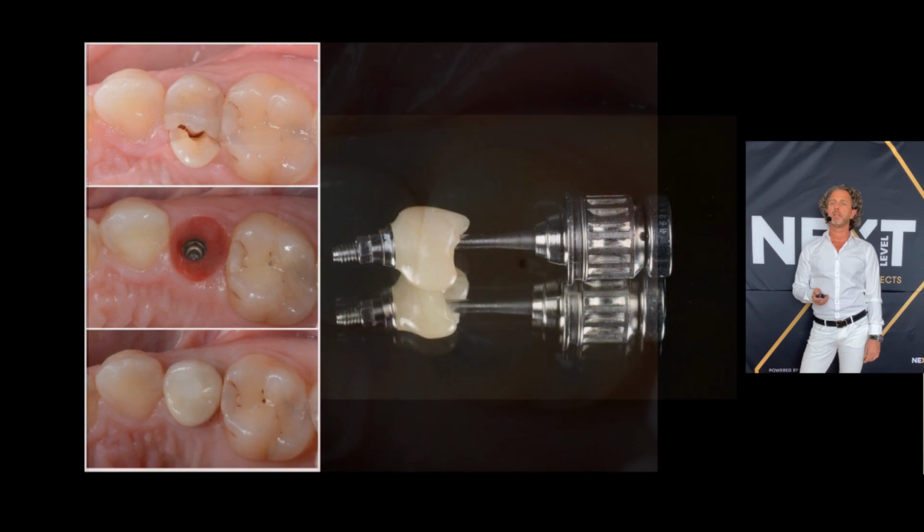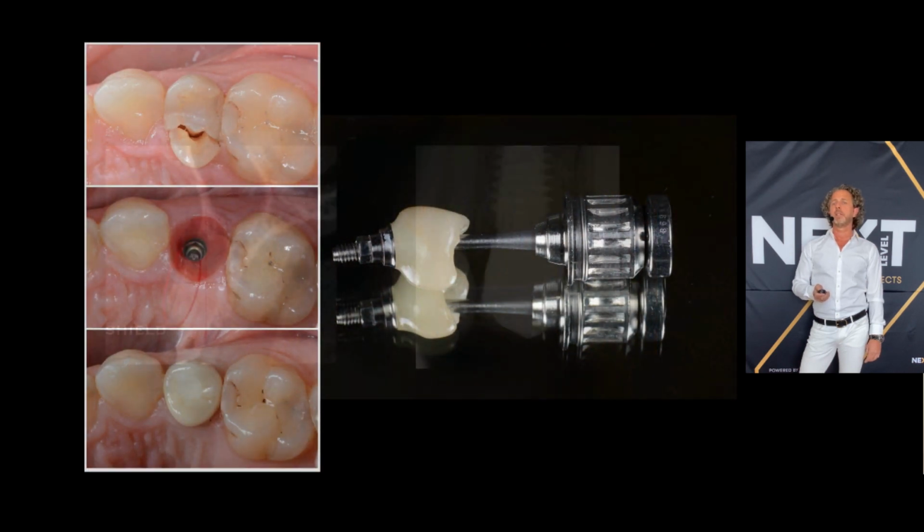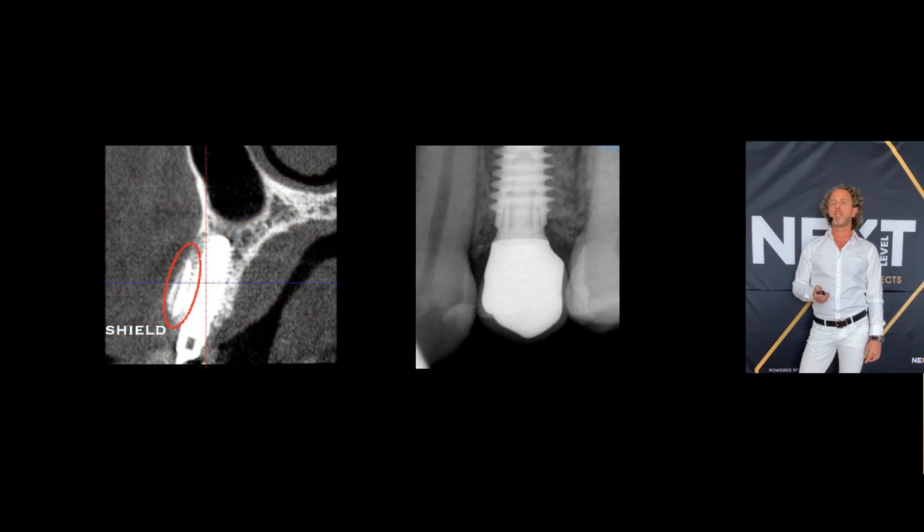This is the final crown, prosthetic solution, CBCT. The shield is clearly visible. The final prosthetic solution with the implant level deeply inside the bone, and we have existing bony peaks which support the papillae.